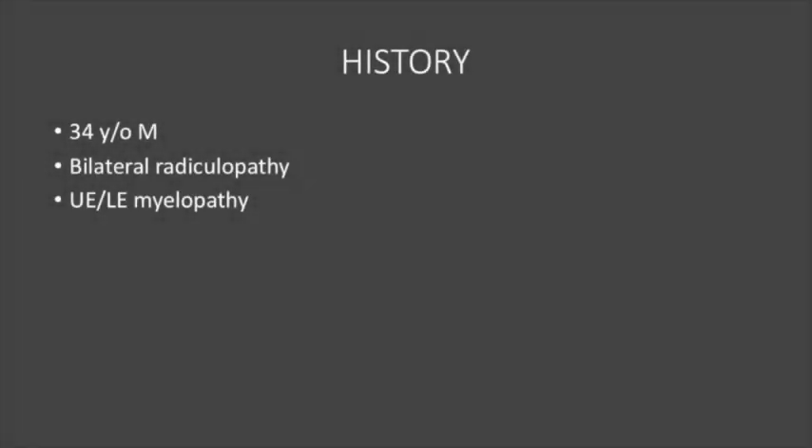This is a video of a microsurgical three-level anterior cervical discectomy and fusion from C4 to C7. This patient is a 34-year-old African-American man with severe bilateral radiculopathy in C6 and C7 distribution, and bilateral upper and lower extremity hyperreflexia with numbness and tingling in arms and legs for three years.